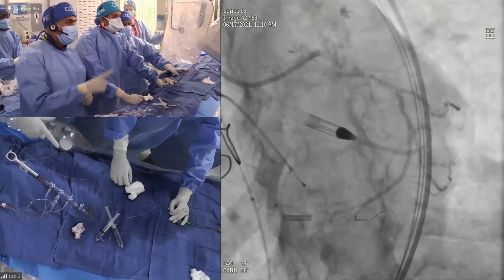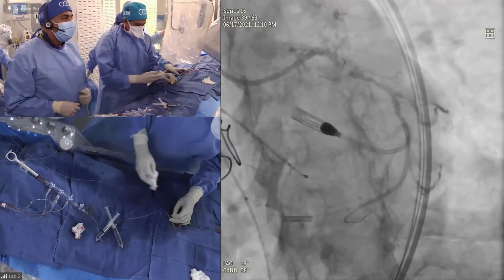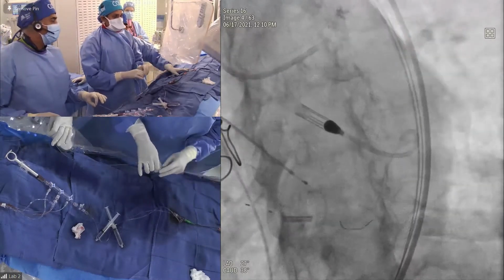We've got to redirect the wire. And it's very easy to trap it inside. Okay, leave it. I haven't done anything. Okay, 1.5 burr, you want? Assist? Right, not easy. Stepping up to the next level. I'm a little worried. What do you think, guys?